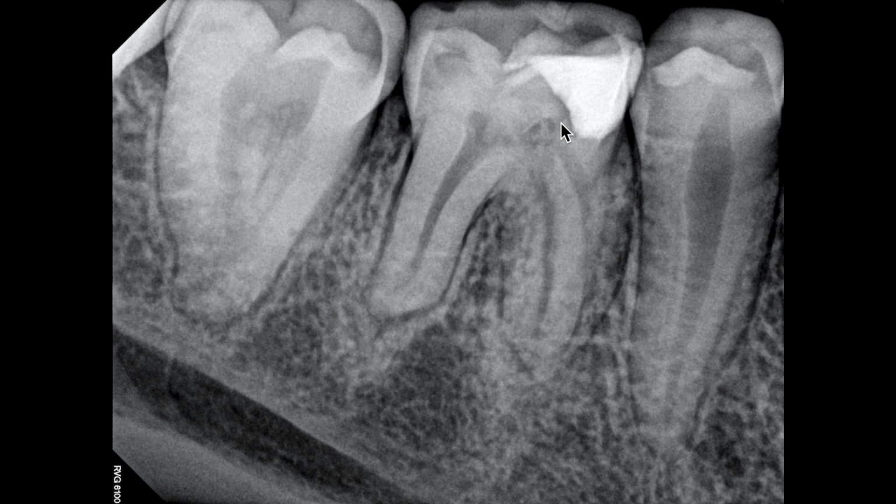There was really strong attrition, with wear facets that were not carious but definitely indented through the enamel. It was symptomatic periodontitis, tender to biting. And if you notice on this 2D X-ray, there is a lot of pulp stone anatomy going on.